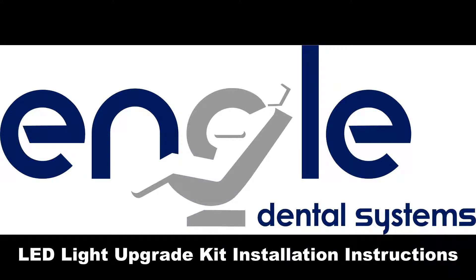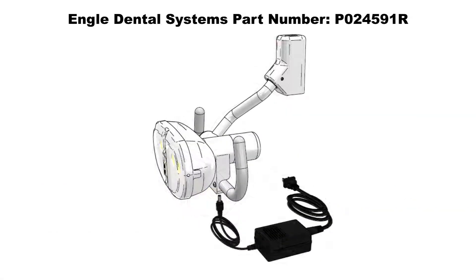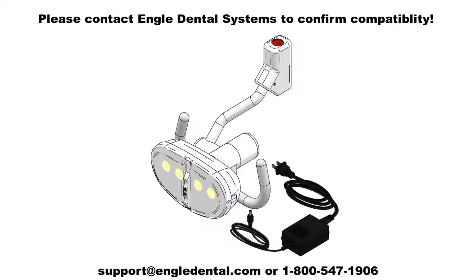LED Light Head Upgrade Installation Instructions. The Ingle 300 Series Light Head Upgrade Kit includes all parts and assemblies necessary to modernize the Ingle 300 Series Halogen System using the original flex arm and support posts. Please consult Ingle Dental Systems before purchasing the upgrade kit, since certain E300 Halogen Systems will not be compatible.